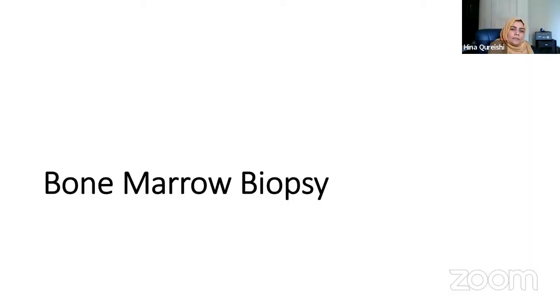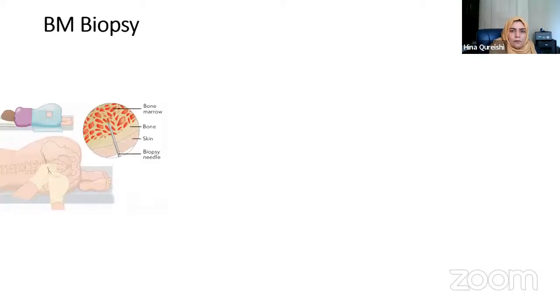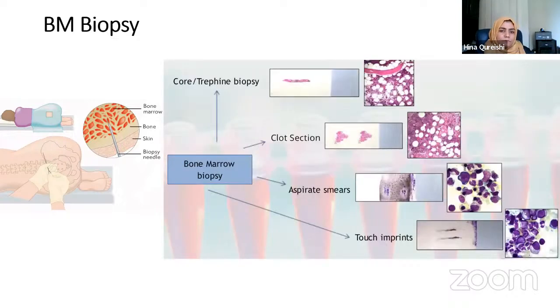Okay, another common test that I do in day-to-day practice is a bone marrow biopsy. And you probably know or you've seen the actual procedure. It's an invasive procedure done in an outpatient setting, at the posterior superior iliac spine. And the bone marrow biopsy has several components, and each component has its benefits.